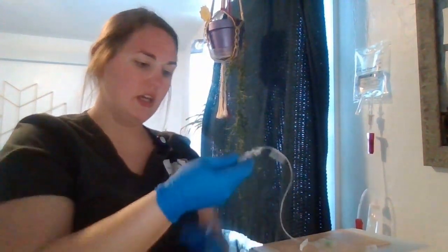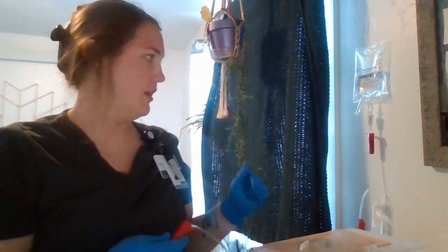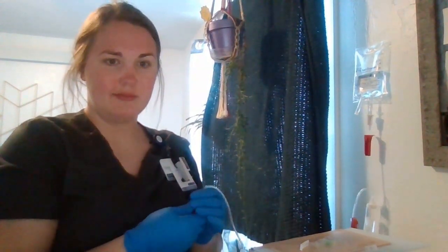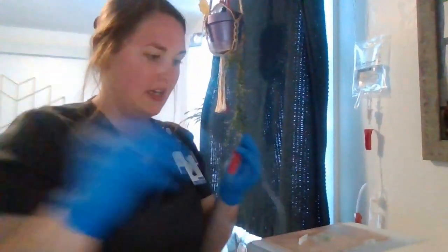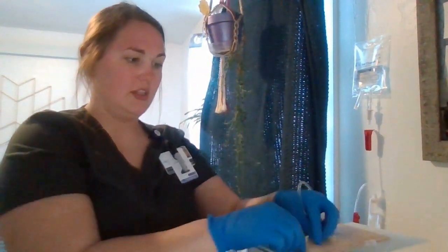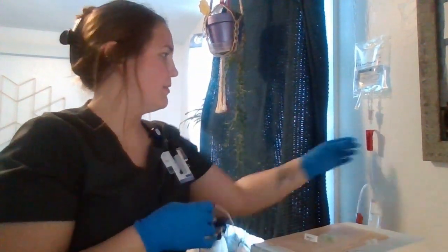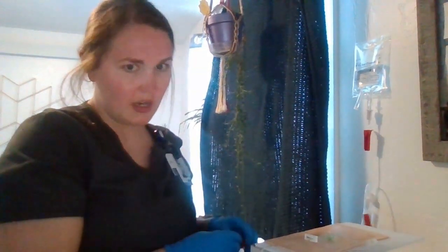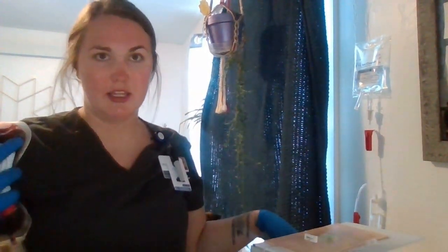I'm going to connect this to my patient. Once I've connected it to my patient, I can then open the clamps. I've opened my clamps and the saline is flowing into the patient. The clamp for the blood is still clamped closed. Once I've done that, I'm going to get my blood and I'm going to make sure that the flow rate is right on the saline.